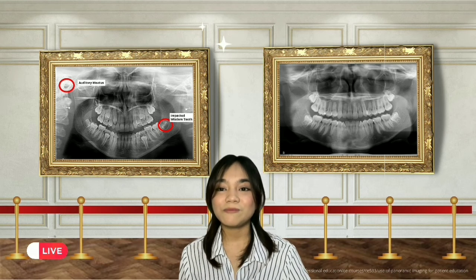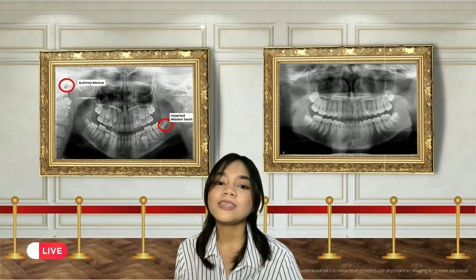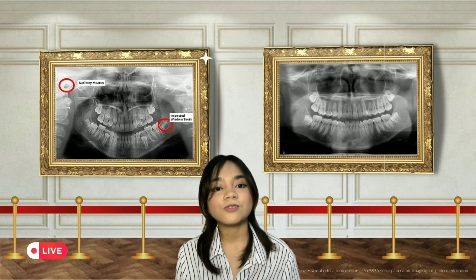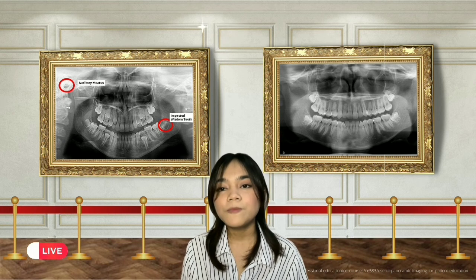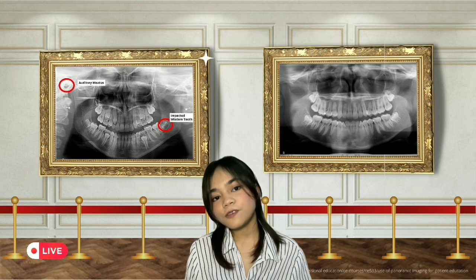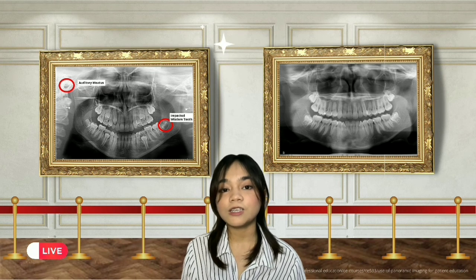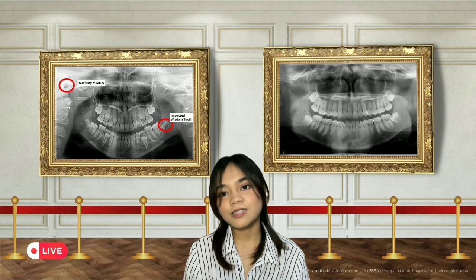So as you can see in the picture, this is from a 9-year-old patient with a mixed dentition. So this patient went back when he was already 15 years old. So through this radiograph, you can see clearly that there is a rotation of teeth 22, and this panoramic radiograph also provided a great visual to help the physician or the dentist to understand the current condition of the patient and how it compared to the imaging from 6 years earlier.